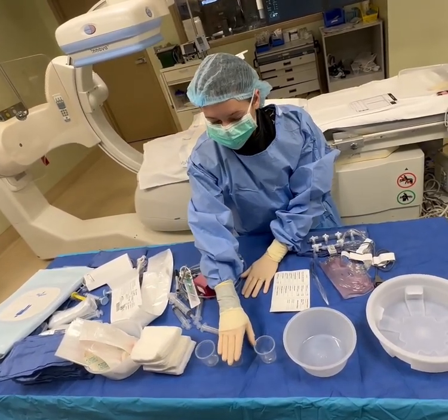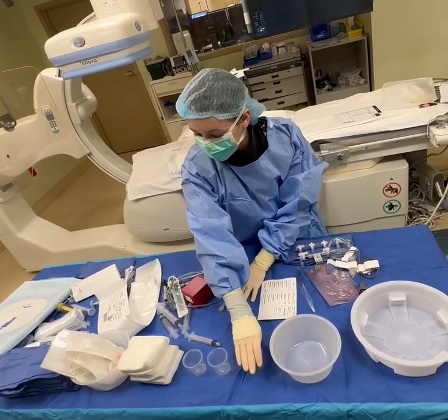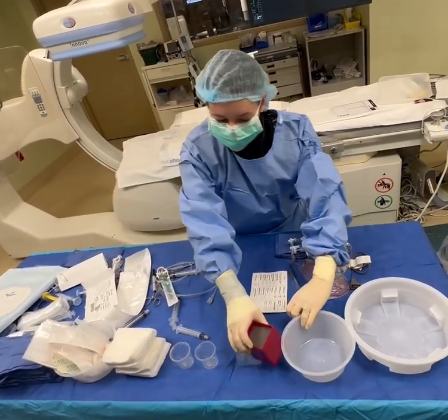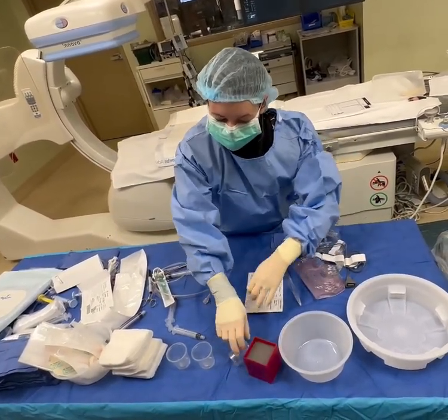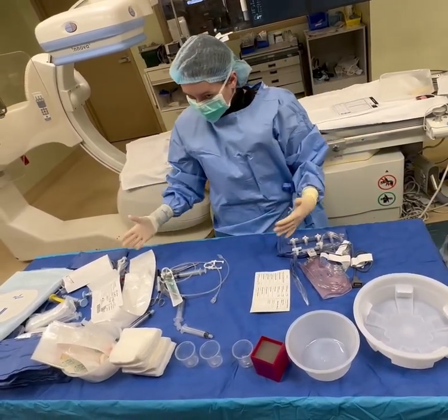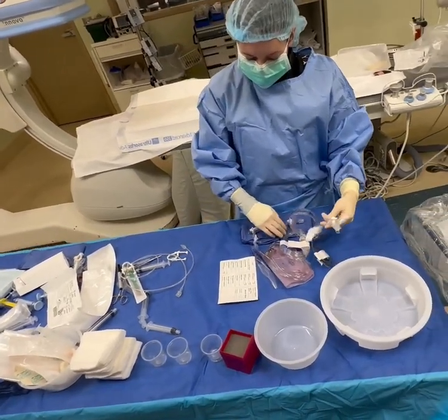One's going to be for nitro, one's probably going to be for a radial cocktail and or heparin, depending on what you get or what you need, okay? All right. I'm going to put my sharps out of my reach because I do not want to stick myself later during the procedure. And now I'm just going to kind of gravitate and clean my table off from here on over, okay? So manifold, your first line is your AO line, okay?